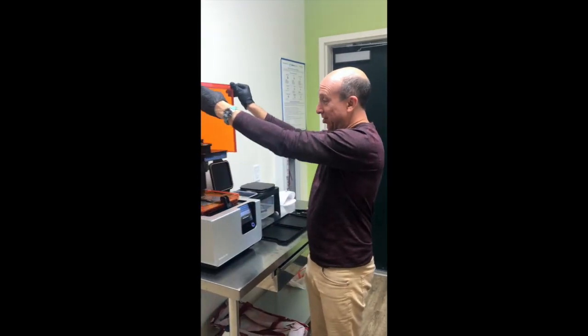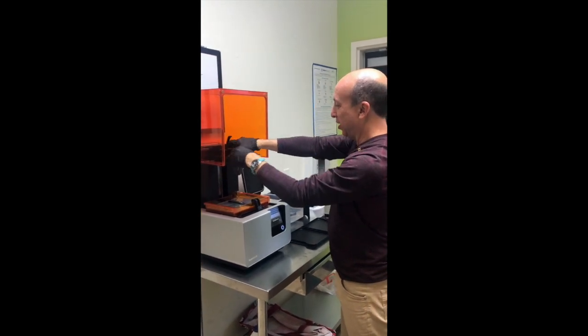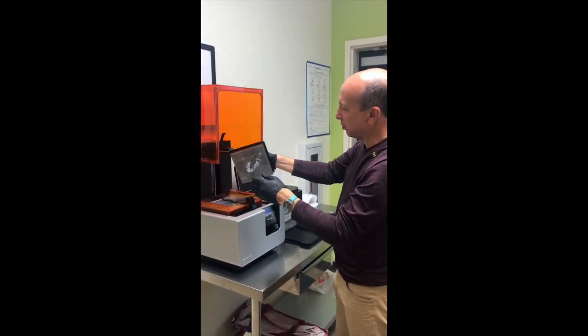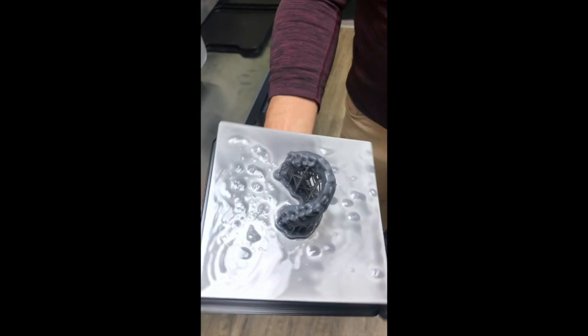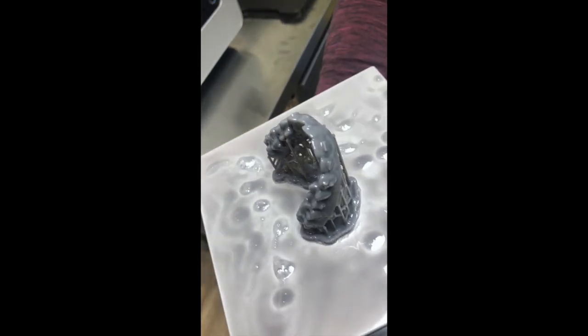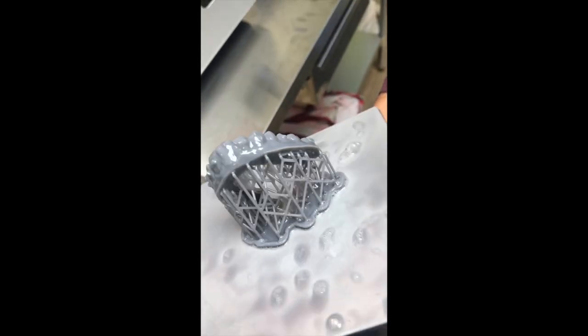Our model is finished and we're going to separate it. Can you see that? Here's the bridge work.